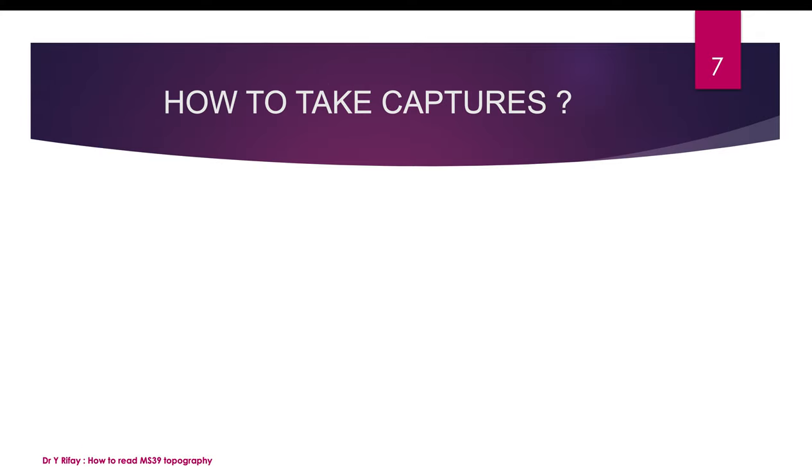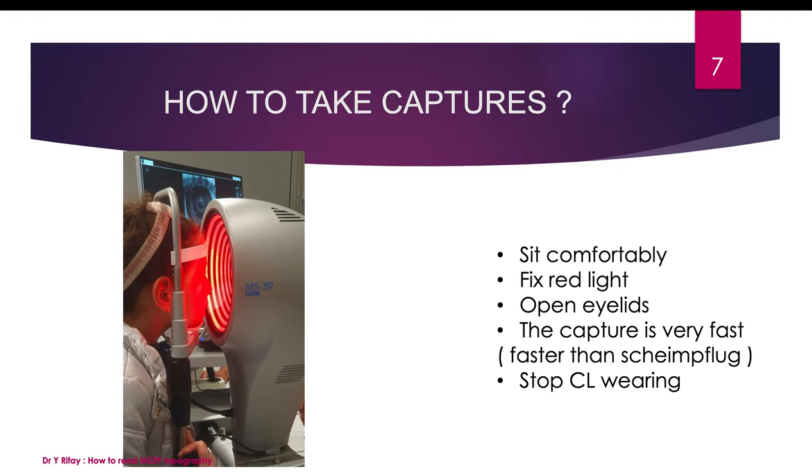How can we take the captures? Is it easy? So the patient must sit comfortably. He should fix the red light and open the eyelids. The capture is very fast. It's faster than Scheimpflug. The patient should stop contact lens wearing for some days before the capture.